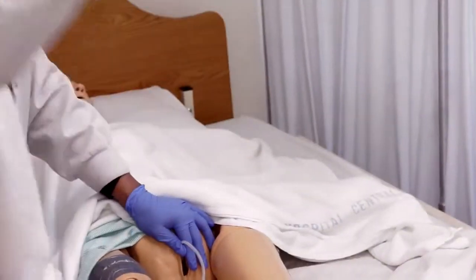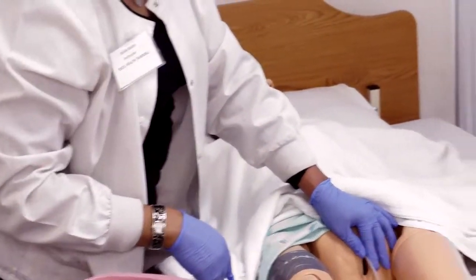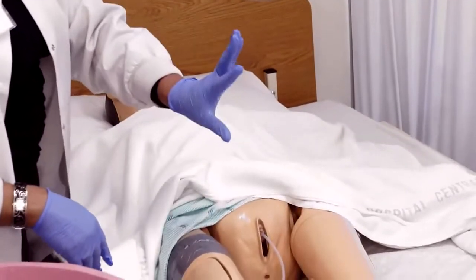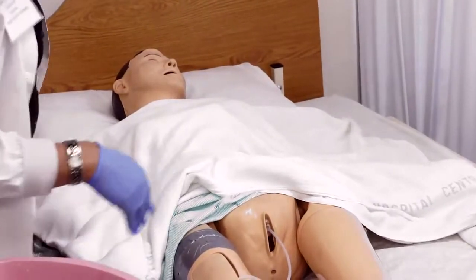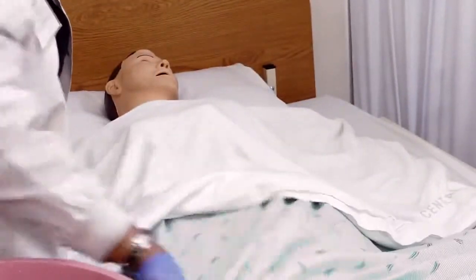And you can also bring the laundry container up as close to you as you need it to be. So now I can let it go. This hand is considered the dirty hand because it held the catheter. Put that behind your back. Clean hand pulls the gown down. The clean hand is the hand that was actually holding the washcloth.